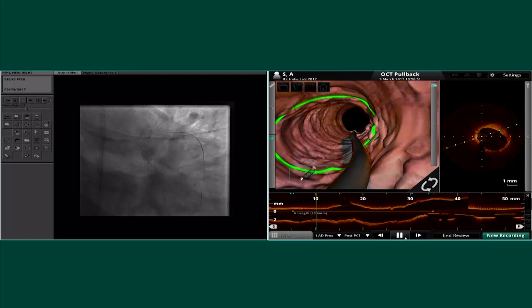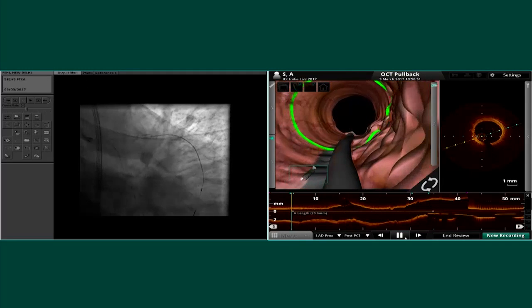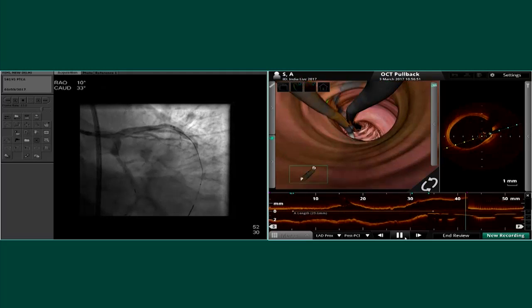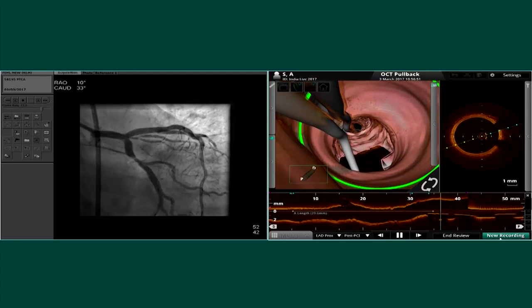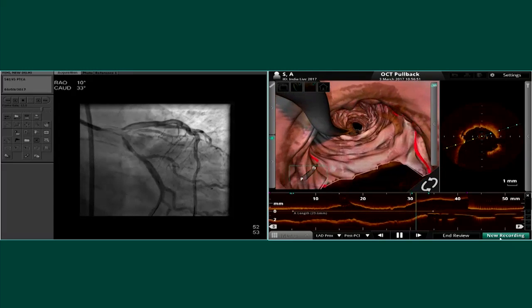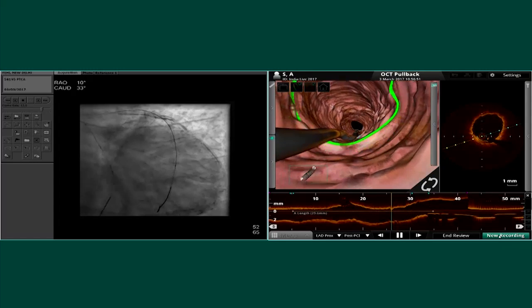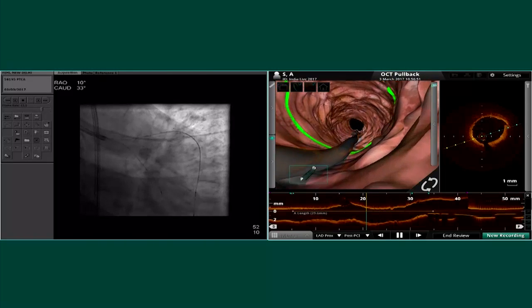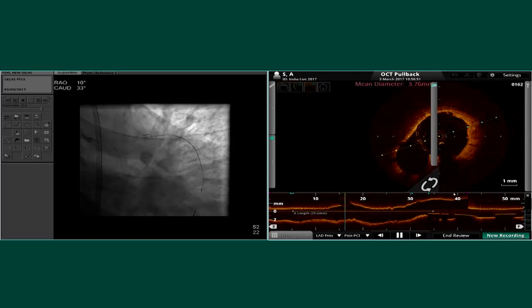Okay, now I'm again going to first take an angiogram and see what it looks like. And now I'm going to study again. You're going to do an optimization. Yeah, I'll do that. But first, in the interest of time, you want to see what this looks like after this 4 millimeters, because I certainly want to optimize distally as well. But I've done this 4 now from the branch backwards, though I'll do the 3.75 at extremely high pressures beyond the branch.